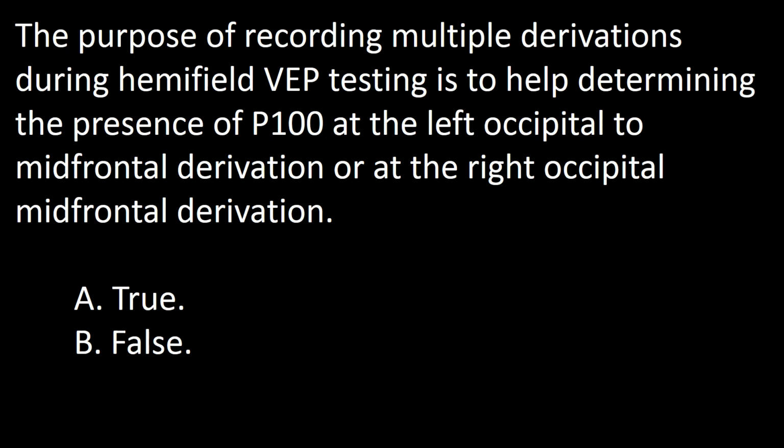Next and final question. The purpose of recording multiple derivations during Hemifield visual evoked potential testing is to help determining the presence of P100 at the left occipital to midfrontal derivation or at the right occipital midfrontal derivation. A true, B false.